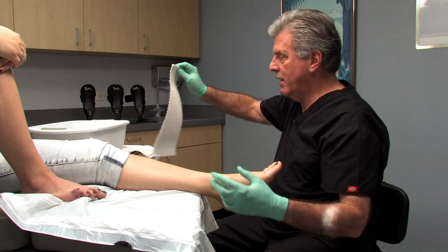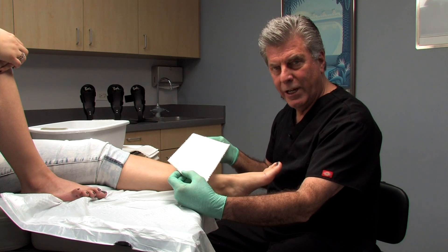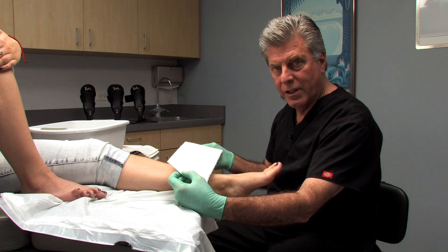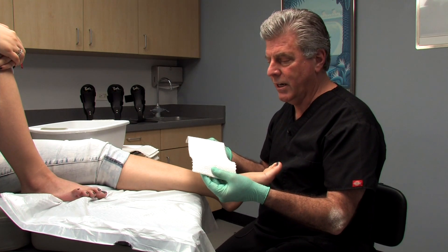When we use plaster of Paris, one of the problems practitioners have is getting the plaster on in a way that there are no wrinkles, bunching, or flaws that actually distort the anatomy of the foot. I'm going to show you a couple of pearls to make sure this is done properly to get the best outcome with your orthotic.